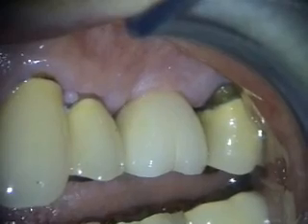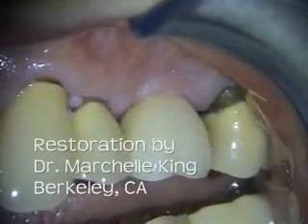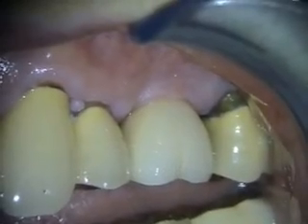This is the final restoration on the implant in the number 14 site, and this was an immediate max implant, and this is about 8 months post-op.